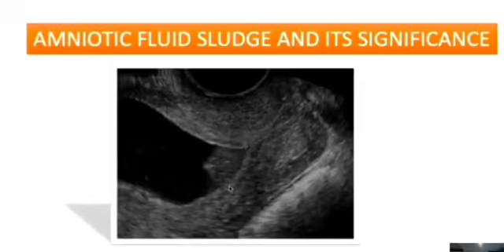Now, the second question arises, what is the significance of this? Now, once the sampling was done and assessment was done of this area, it was found that a lot of bacteria as well as neutrophils, a very high percentage of neutrophils. So basically it is having germ cells, microbes and inflammatory cells. Now this has been seen to represent inflammation or infection.